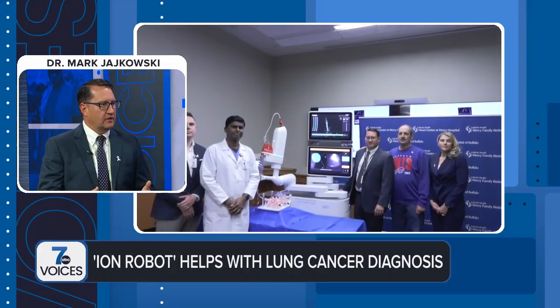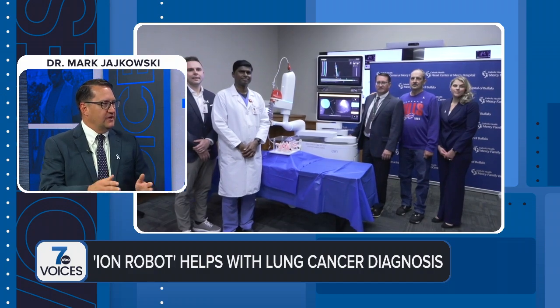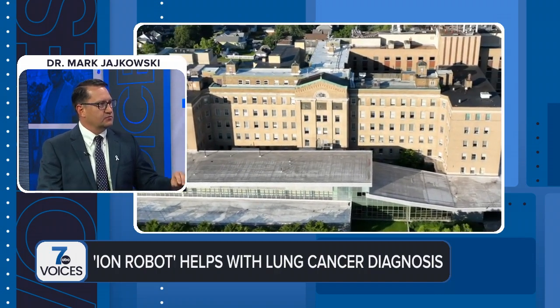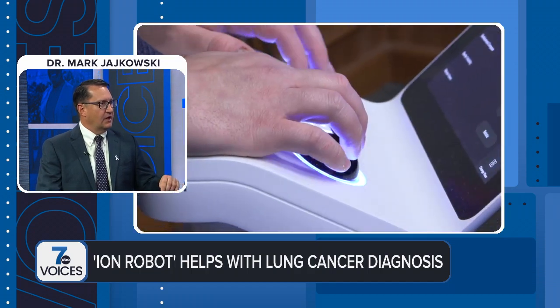Tell me about this piece of machinery. It seems like especially in medicine, things are constantly evolving, right? You always want to have the latest and greatest, and this seems like a significant addition. Right. So this is technology that's relatively new. Navigational bronchoscopy has been around in different forms. This is the first one that uses computer-generated pathways to direct a tiny catheter out to peripheral areas of the lung where you're able to take samples of small lung nodules that may not be accessible by other means.